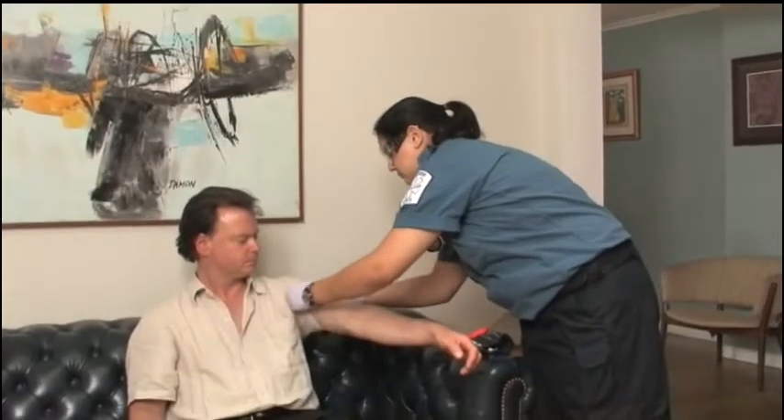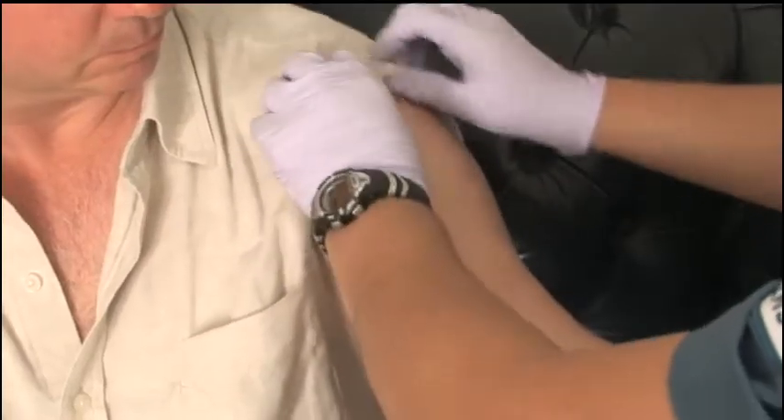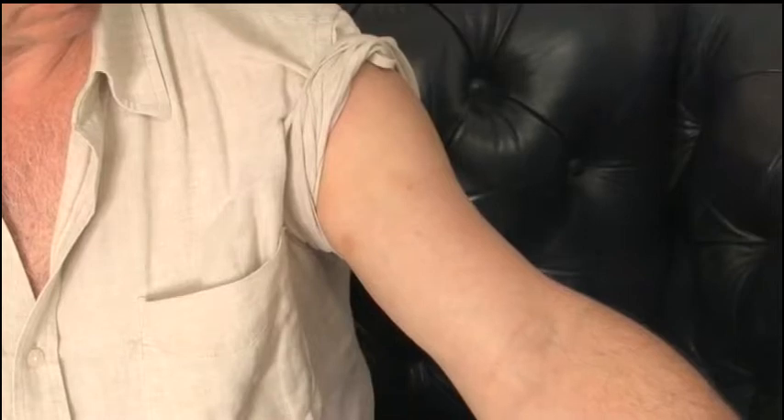Begin the blood pressure measurement by removing or rolling clothing to expose the bare skin of the arm. Be sure that the sleeves, when rolled, do not occlude the arteries of the arm preventing blood flow. If the shirt is that tight, remove the arm from the sleeve.